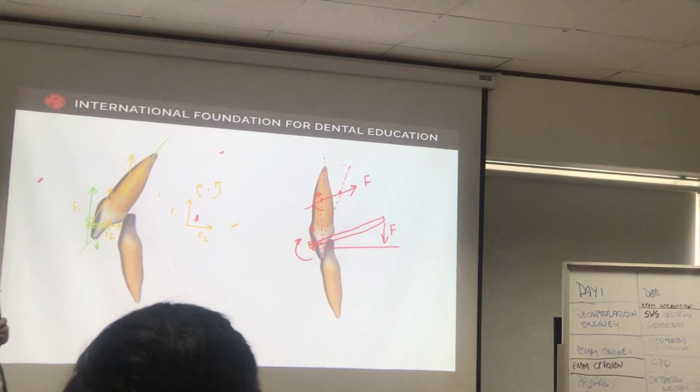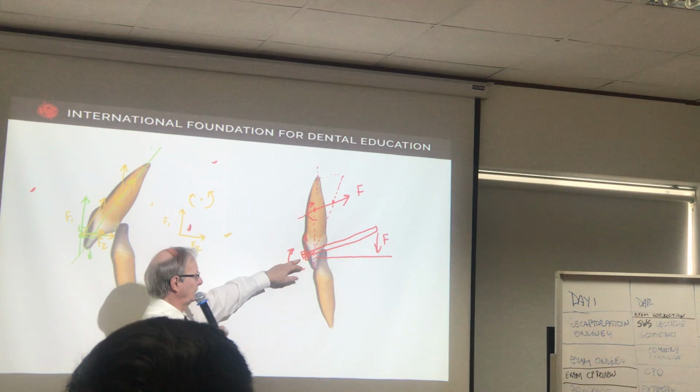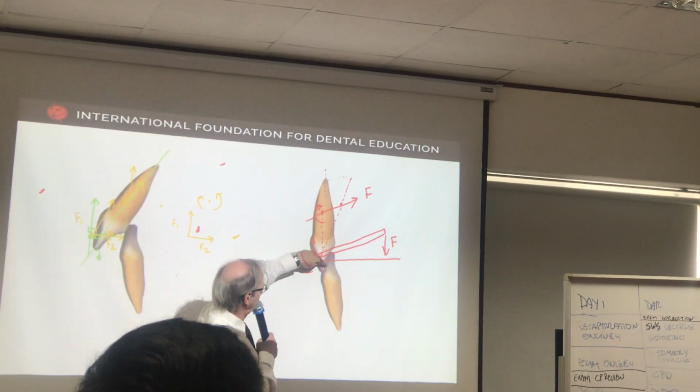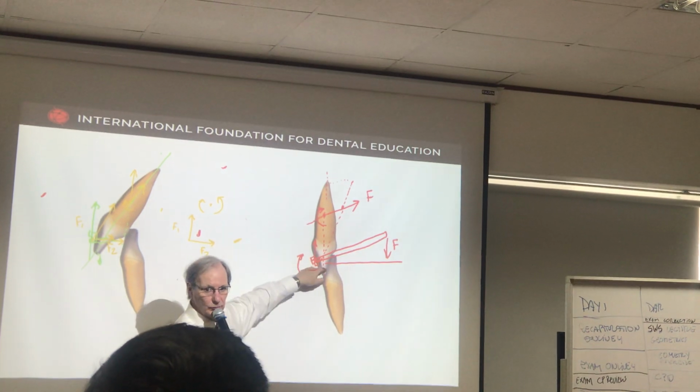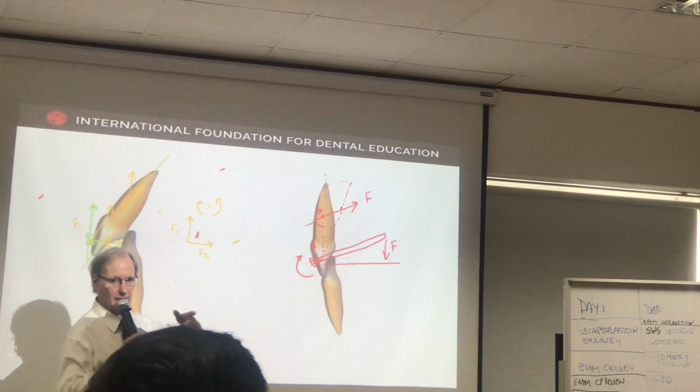Yeah, but I'll tell you what we have to do, because this is the torquing arm, it's very powerful, but you also tend, because you rotate here, this tends to come forward. So you have to stop it. And then as soon as you can, you go back to this.